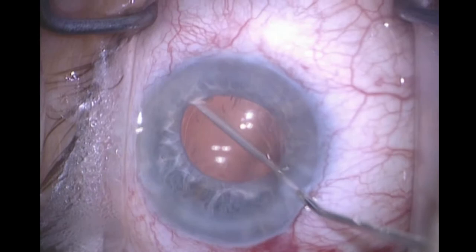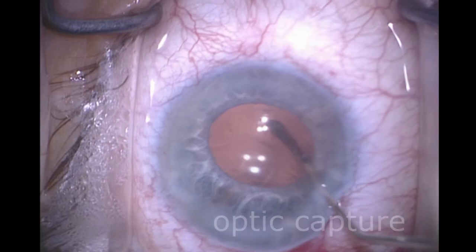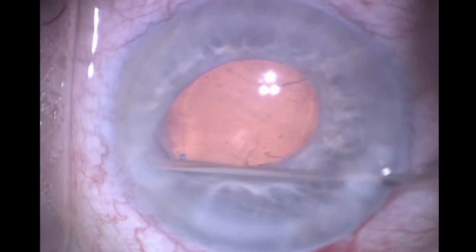That way, when there are lateral saccadic movements, the haptic will bear some of that inertial displacement force. I then capture the optic to prevent the IOL from rotating or decentering, and it also prevents contraction of the CCC. I don't have to adjust the IOL power, and I'm just checking to make sure that the optic is in the bag.